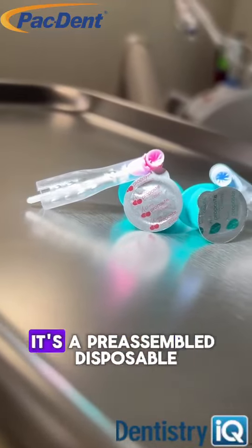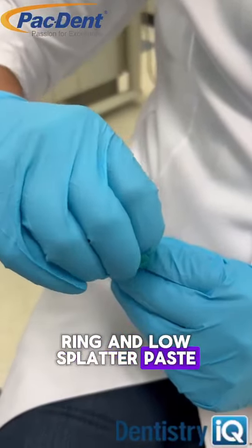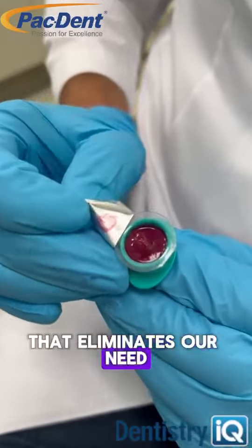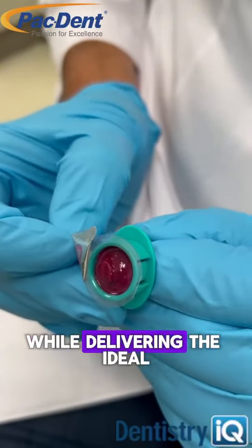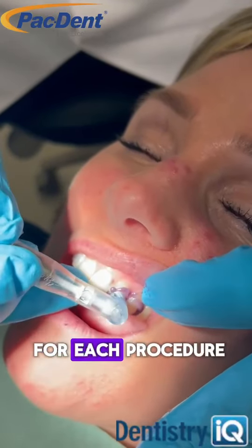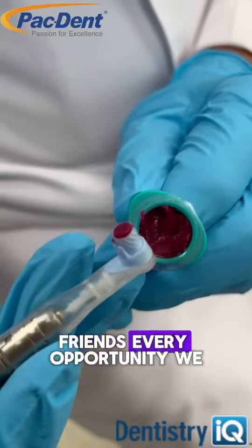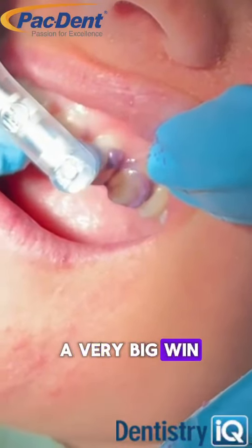Let's start with ProPaste 1. It's a pre-assembled disposable ring and low-splatter paste. That eliminates our need to autoclave or sanitize rings in between patients, while delivering the ideal amount of desensitizing, low-splatter prophy paste for each procedure. Every opportunity we have to improve patient outcomes and control time is a very big win.